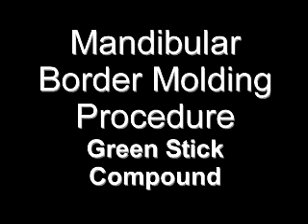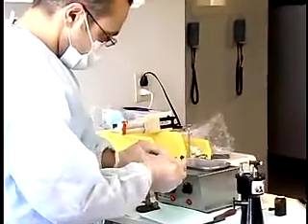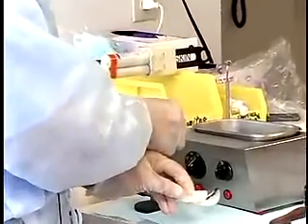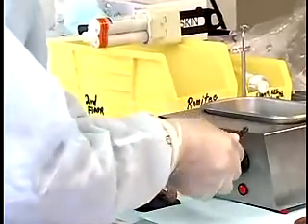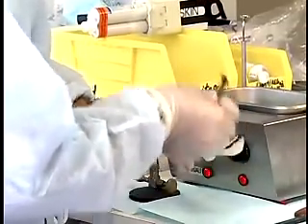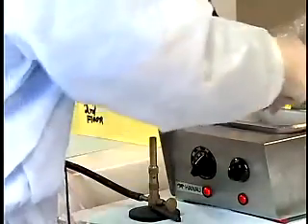Soften one end of the green stick compound slowly over the alcohol torch. Add compound to the border of the tray from the right buccal frenum to the right retromolar pad. Flame and temper.